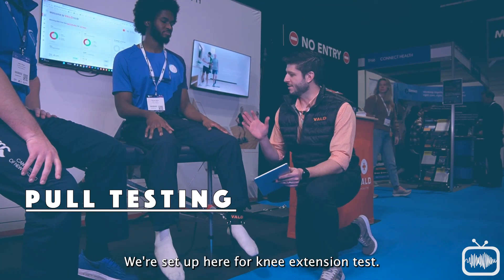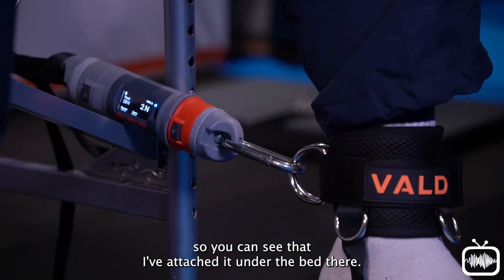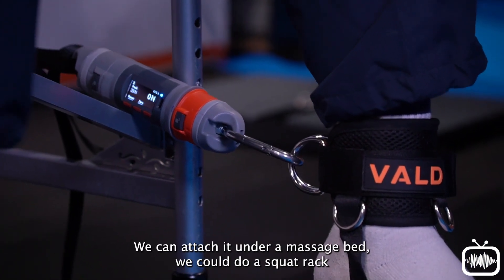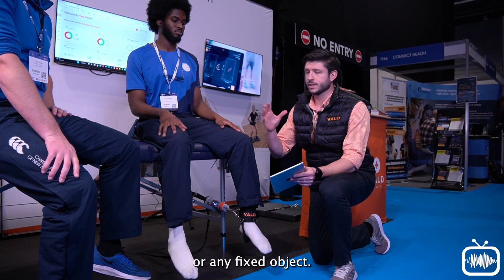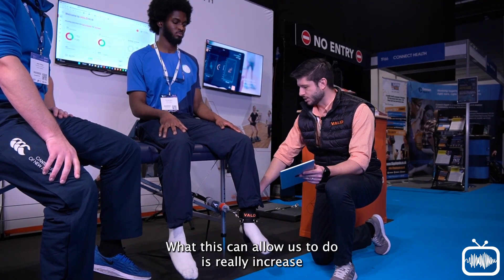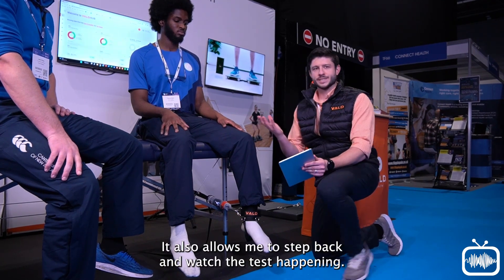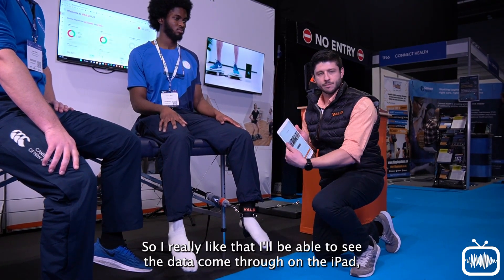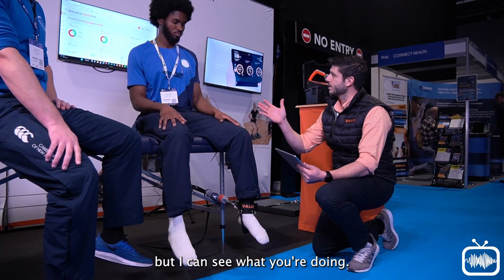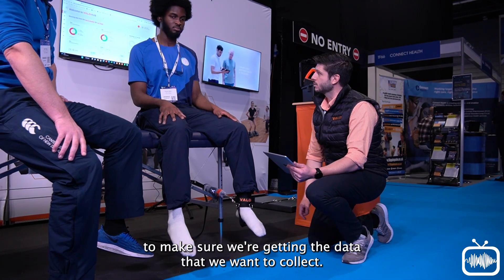We're set up here for the knee extension test. I've put the Dynamo with the tension links — you can see it attached under the bed. We could attach it under a massage bed, a squat rack, or any fixed object. This really increases the reliability of the data we get, and it also allows me to step back and watch the test happening, seeing the data come through on the iPad while observing for any compensation in the movement.